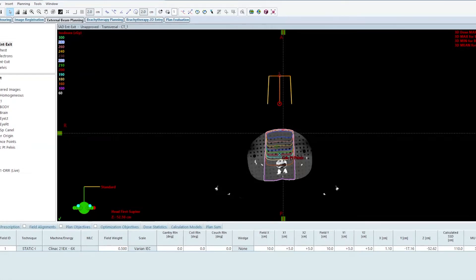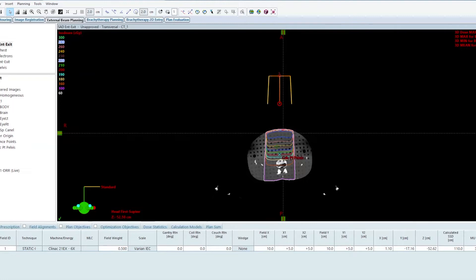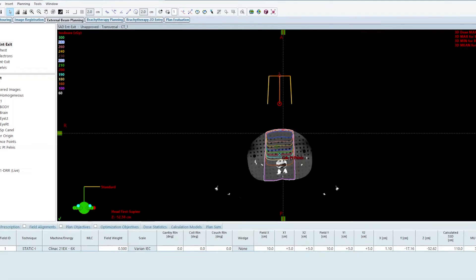Basically it's an AP/PA field arrangement and the reason we use the extended distance is because the fields are only able to do roughly a 40 centimeter field size. If we need something larger than 40 centimeters, we have to take advantage of the magnification of the field by extending the SSD. You just extrapolate this to multiple fields but the concepts remain the same.